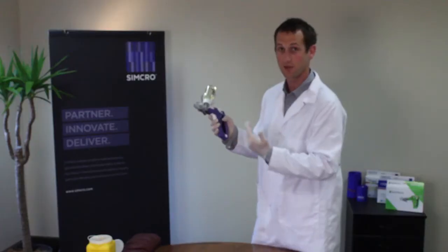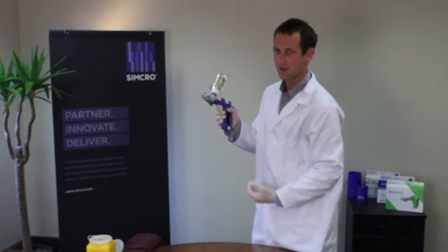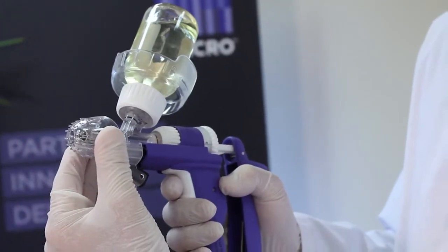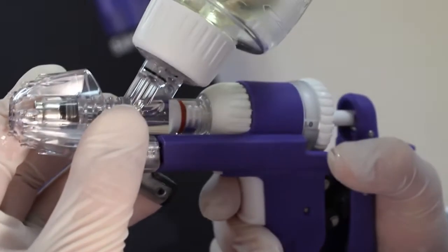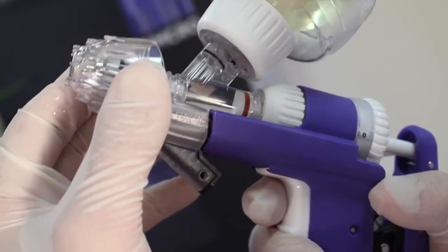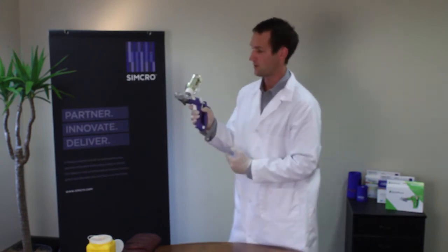To prime, we follow our steps again. This time, instead of pressing into the animal, we have to retract the needle guard by hand — so fully retract that. Then obviously the handle is free and you can pump that through to bring the product through. Holding it up, we simply push the air out of the barrel, and now the injector is ready to use.